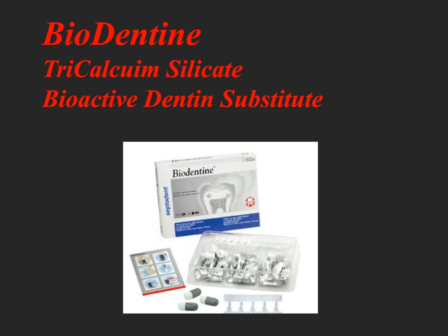Biodentine, or tricalcium silicate, is a bioactive dentin substitute. We've already mentioned bioactive liners, cavity liners, and bases. This is a bioactive foundation material.